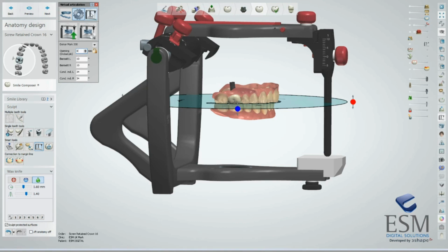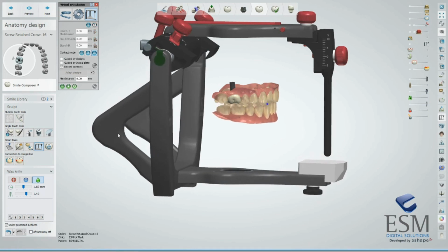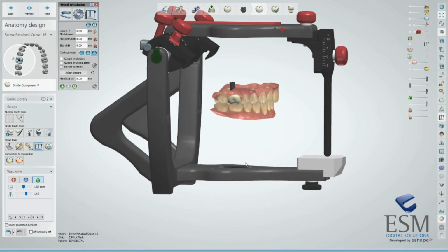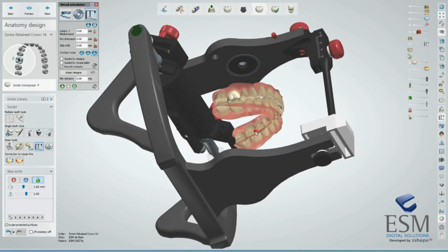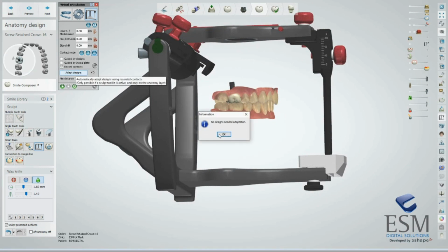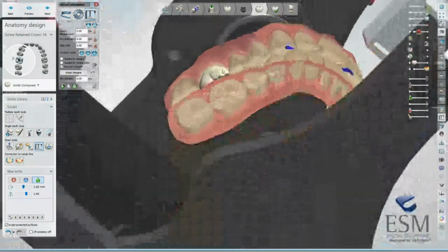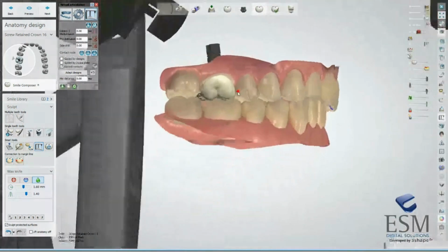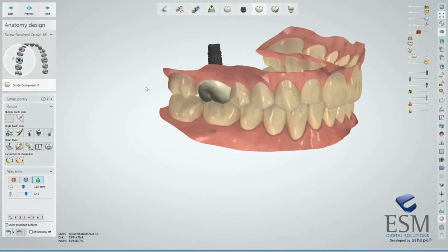If I want to play those motions, I can click onto that, and then if I press play on here, you can see now it's going to do some fixed average value movements on there, and you can see there's some coloration on the teeth where they have been placed. I can also adapt that design if I wish, so I can click that. You can see there that there's no movements or no tooth that's actually connected to that. Once I finish with that, I can click close.